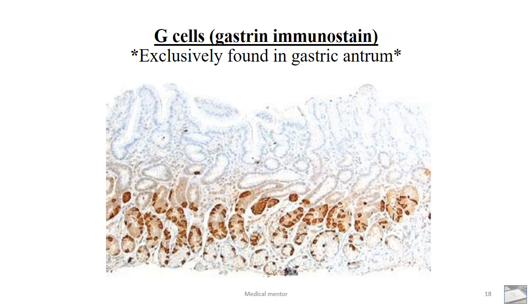This picture shows a gastrin immunohistochemical stain that highlights a band of G cells. These G cells are exclusively found in the gastric antrum, and their presence can be exploited to identify the site of tissue origin. The cardia, although it has similar mucosal deeper glands, would not have gastrin G cells and thus lacks the gastric gastrin immunohistochemical stain.